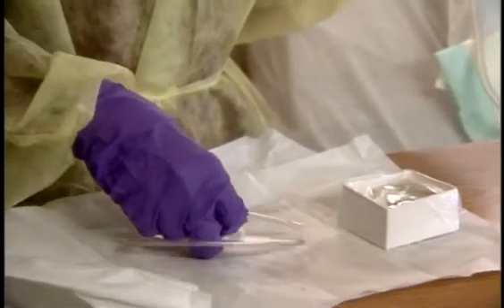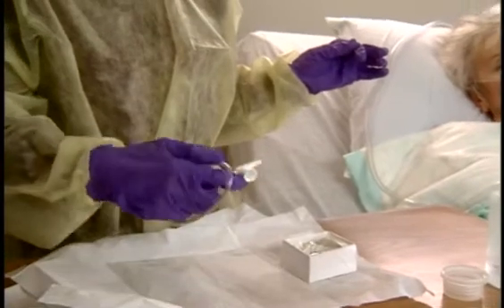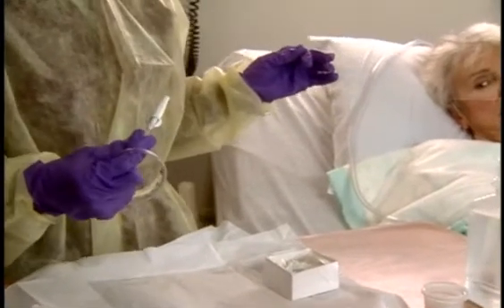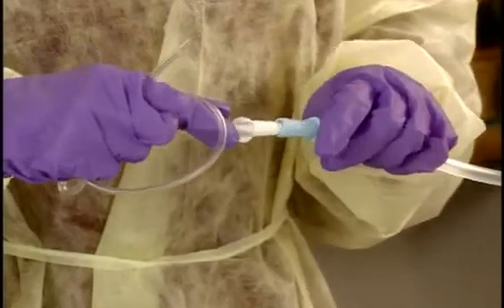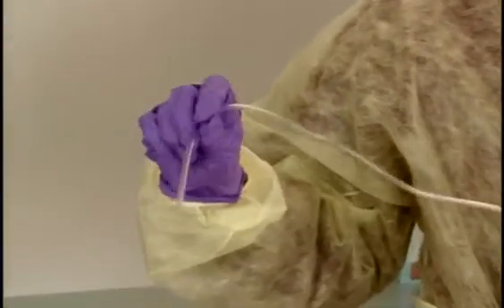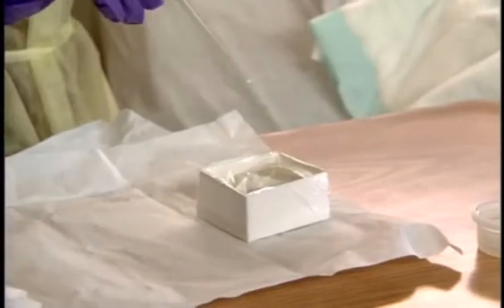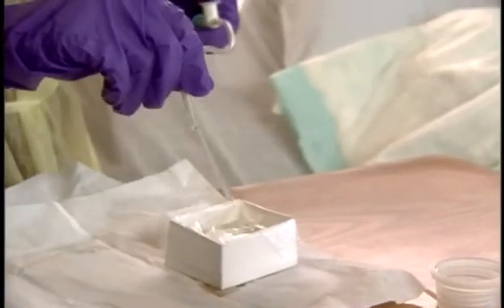Use your non-dominant hand to connect it to the suction unit tubing. Don't touch the sterile catheter with your non-dominant hand. Okay. Right. Now I dip the catheter into the sterile saline to moisten it. Occlude the Y port to check the suction. The saline solution should flow through the tubing.